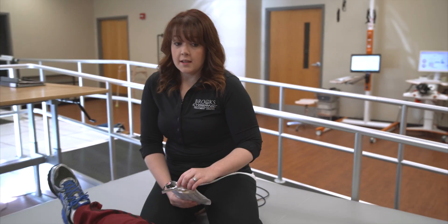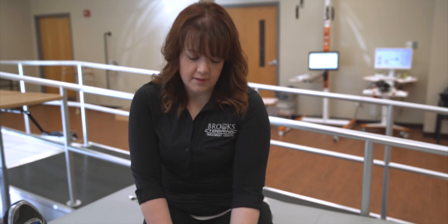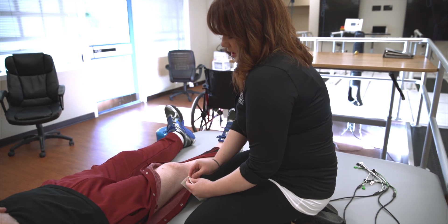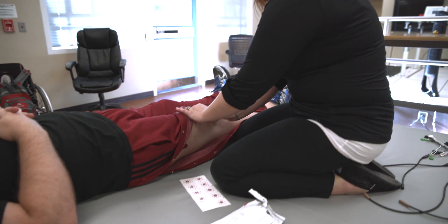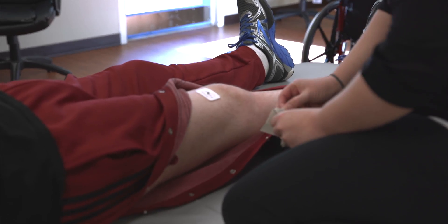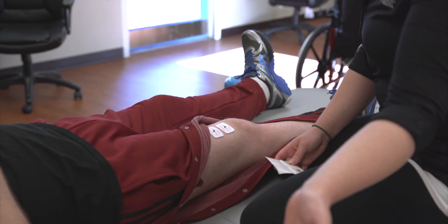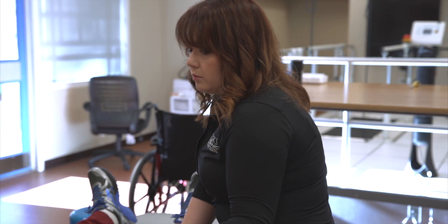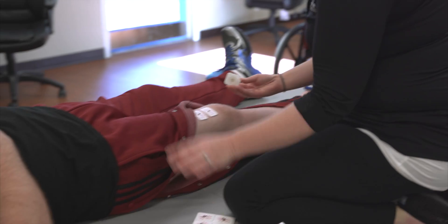I'm going to be getting the sensors on for Maverick to attach the leads to the robot so that it can read the signals that his body's generating. The robot uses these monitoring electrodes to pick up any residual signals that a person has after a neurological injury, particularly spinal cord injury. It uses those signals and reads them to initiate movement with the robot, so everything that is moving with HAL in a certain mode is fully driven by what the patient has going on internally and by their signals.